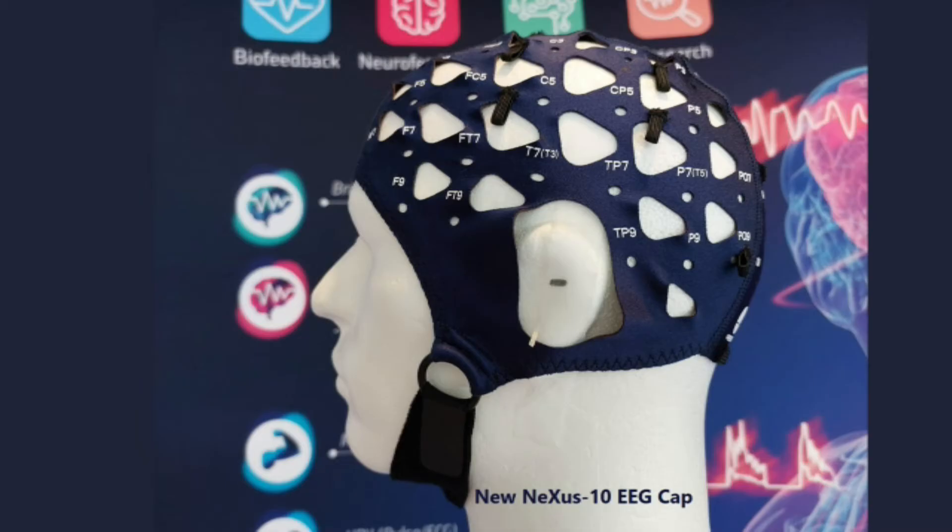We're super happy with this — we created this solution just one month ago. We're going to show this cap at the ISNR; if people want to see a demo, we can do it in one minute or less, four channels, no artifact, you can start training right away with minimum gel. The fully semi-dry solution — where you're not even using gel — will be on the market sometime next year, but I can't give a date yet.